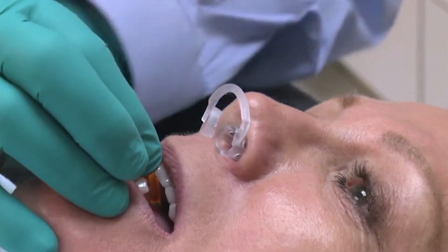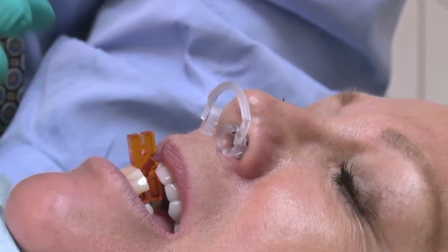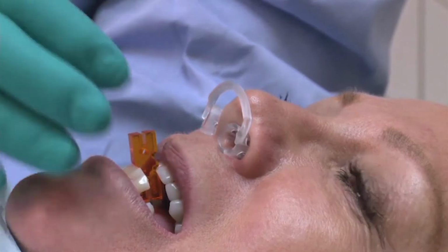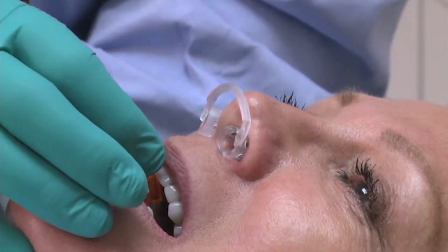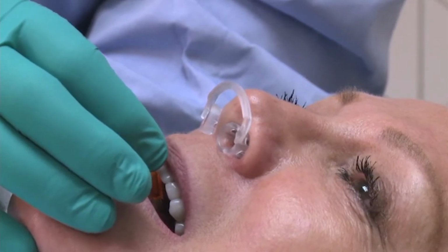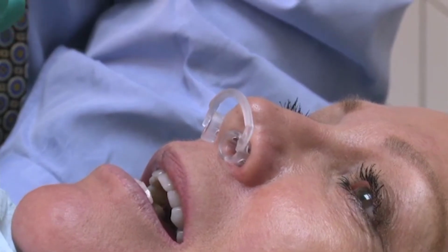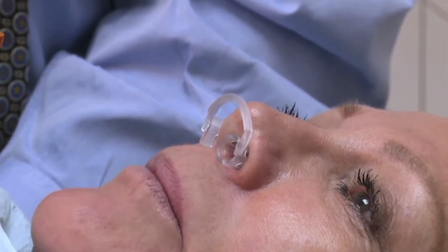Good, right there. I'll take my fingers away just for the video so you can see how it's positioned. I'm going to hold it. Give us your best snore, Kim. All I'm hearing is air. That's what an awesome sound. And open. Just for demonstration purposes, let's try 3 millimeters of horizontal.